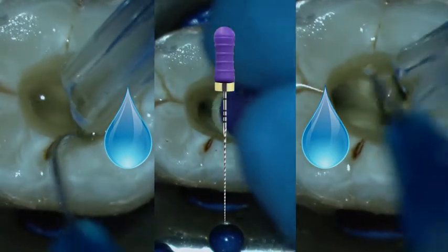The canals are now ready to fill. As you can see, a minimum number of instruments and a minimum amount of time is required to prepare these canals. The added bonus is that these instruments do the job with a minimum amount of binding and even less of an opportunity for instrument failure. Put the ProTaper Next instruments to the test in your practice — I think you will find that they provide the simple and safe treatment protocol that you've been looking for.